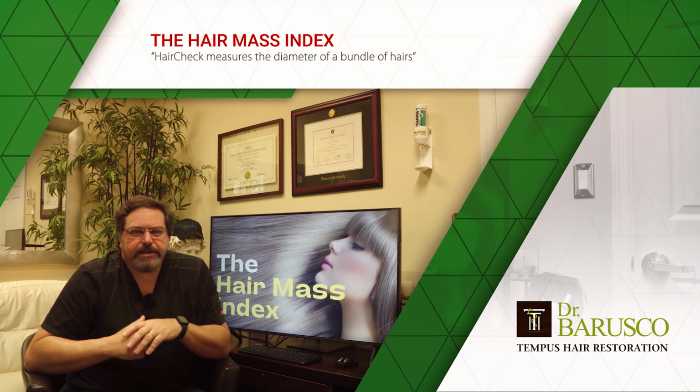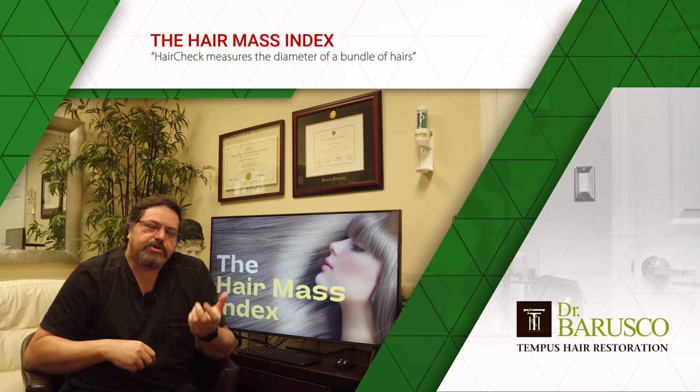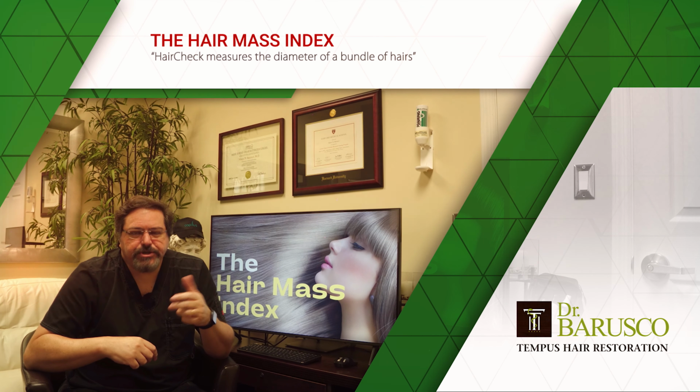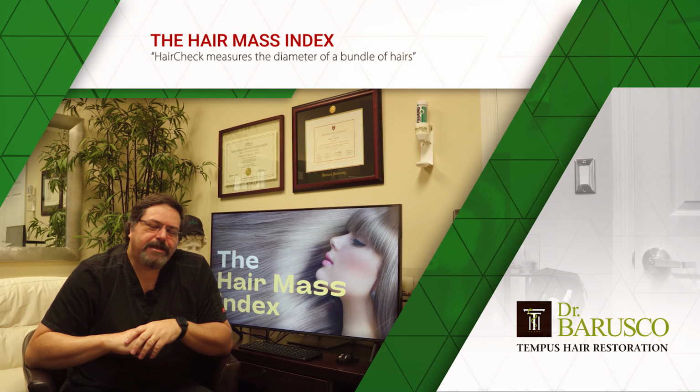So again, there'll be more detail in the video here following. And then in the end, we'll do some conclusions. But it's one of the things that we use to, again, track your hair loss, help us diagnose. It can also track hair breakage and velocity of hair growth. So it's very useful and it's very simple to do. So let's watch how it's done and then we'll come back later.